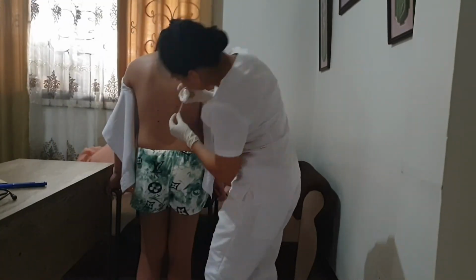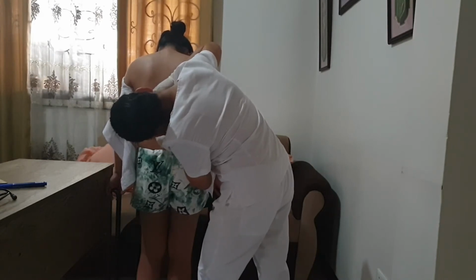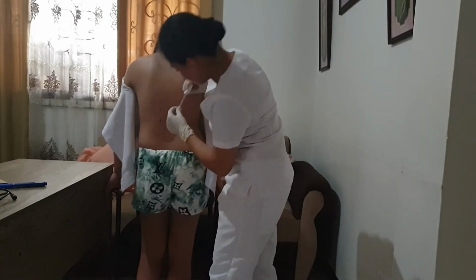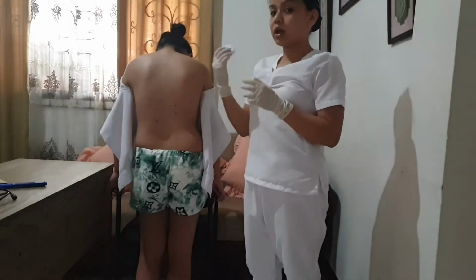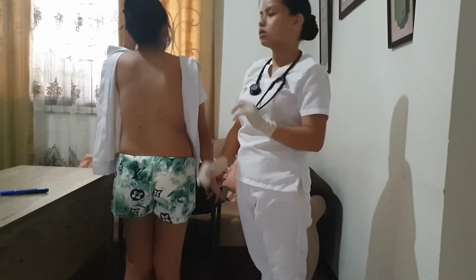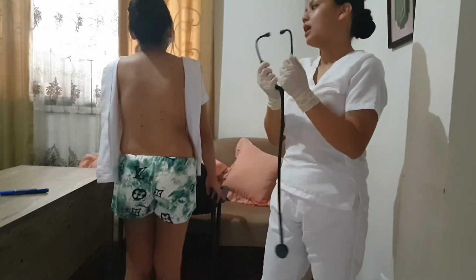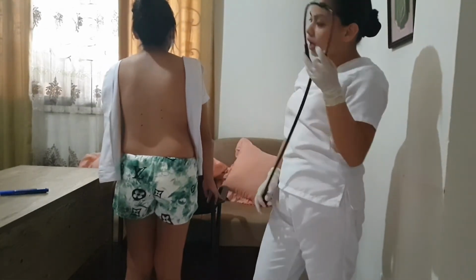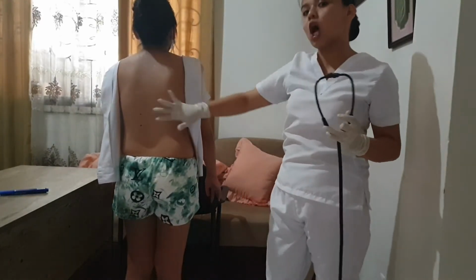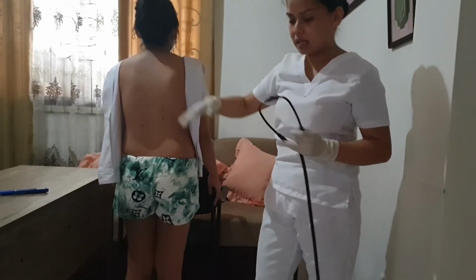And we are going to measure it. So I have already measured it. Now we move on to auscultate the breath sounds. For this one, I am going to use my stethoscope now. And I am going to start to position it on the apex of her lungs at C7. Also, I am going to observe her breath sounds on both sides.